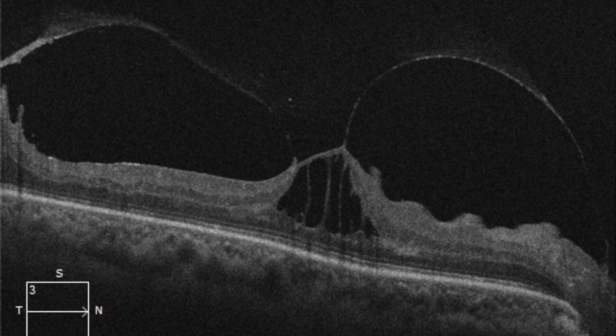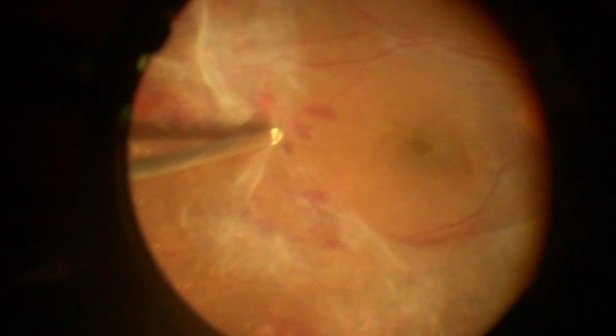This is the case of a young diabetic patient with progressive vitreomacular traction syndrome, which prompted surgical treatment with pars plana posterior vitrectomy. The surgeon begins with vitreous circumcision. Next, the process of segmenting the areas of vitreoretinal traction is initiated.